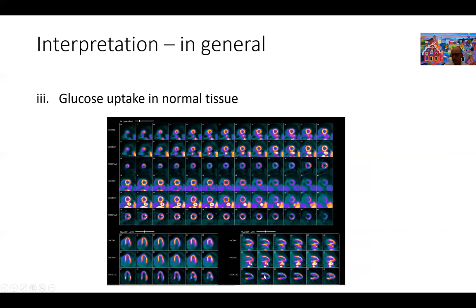This is a reason why you should always compare the FDG images with perfusion images. From this hibernation study, we're not talking about inflammation here; we're talking about detection of hibernation, the way the study is protocoled for hibernation. This is physiologic FDG uptake and it doesn't mean much really. You have normal perfusion at rest and post-stress, no ischemia, no scar, and the FDG is just physiologically heterogeneous in different segments of the myocardium.